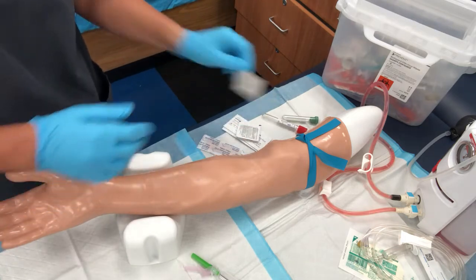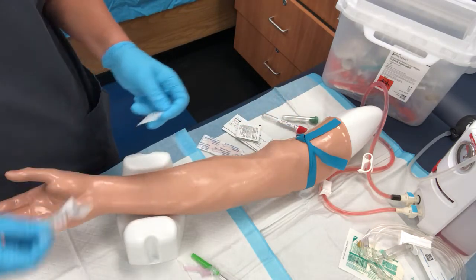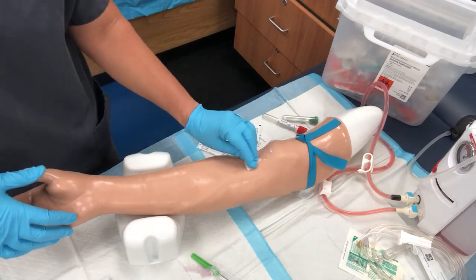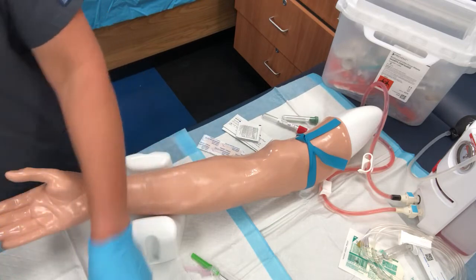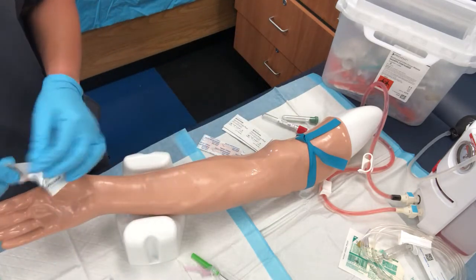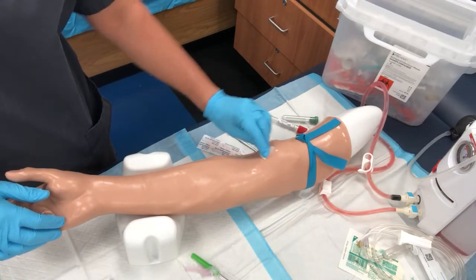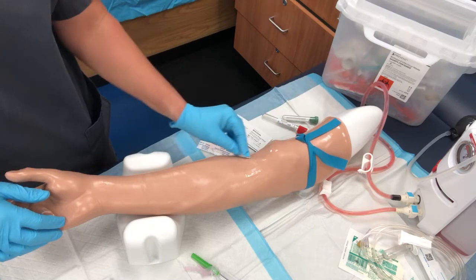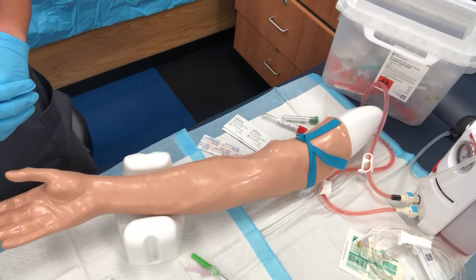You can take your alcohol. Again, we've got the 2-minute timer. Someone probably is timing me at home. And we're going to wipe away. And if you are concerned that you maybe contaminated the area, or if you're just concerned about hygiene for the patient, not a problem to go right back in the same area and do it again, just making sure that you're using a separate alcohol swab. So we're gonna let that area dry.